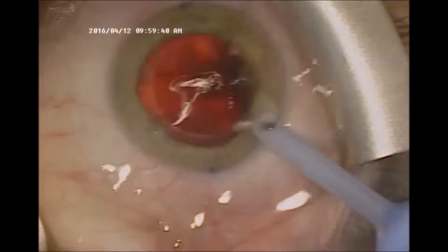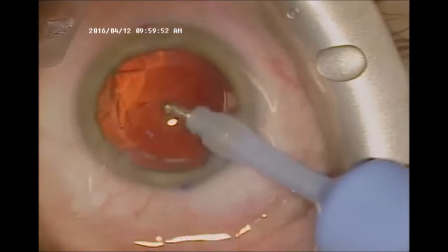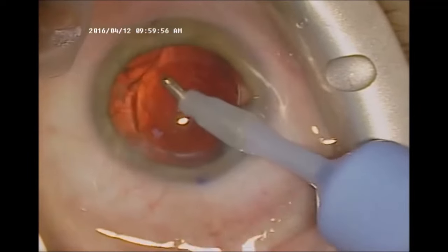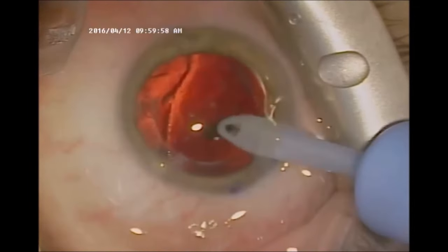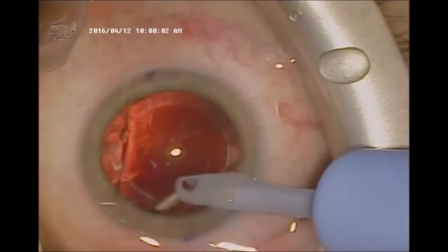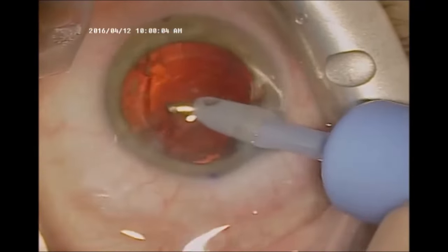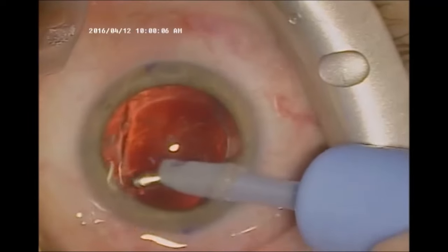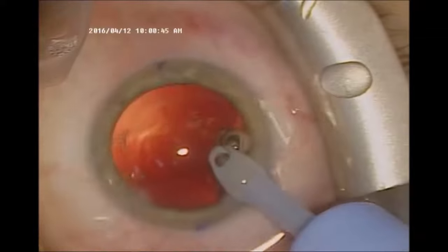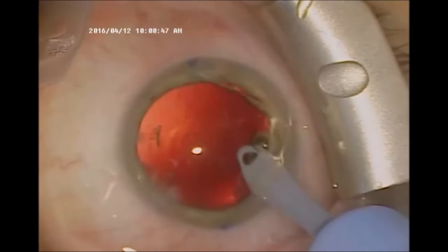Now that it's all been removed, jumping ahead, this is another segment called the Irrigation Aspiration, where I remove any lens materials which are still adhered or attached to the natural capsule. I typically start right underneath the wound, then move around in a clockwise fashion, finishing over here.